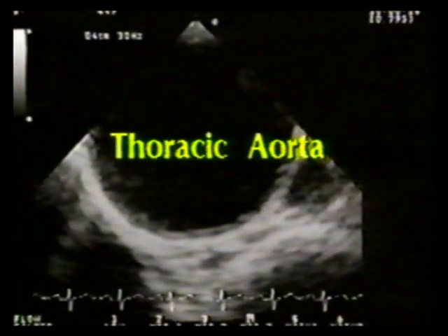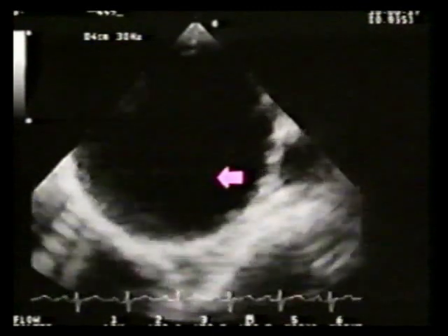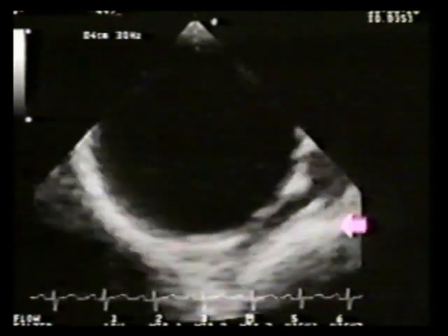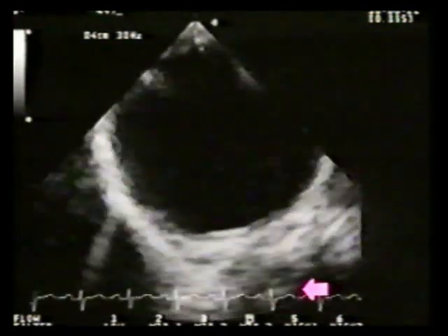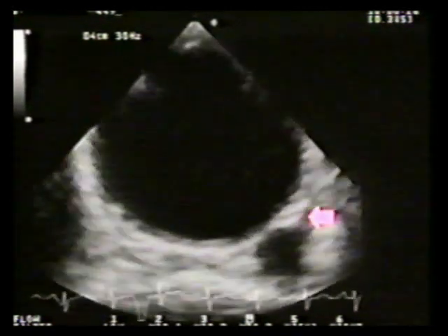This is a transesophageal echo of the mid-thoracic aorta. The transducer is intimately adjacent to the aortic orifice. Posteriorly is the vertebral body. Note that the azygous vein lies just posterior to the aorta.